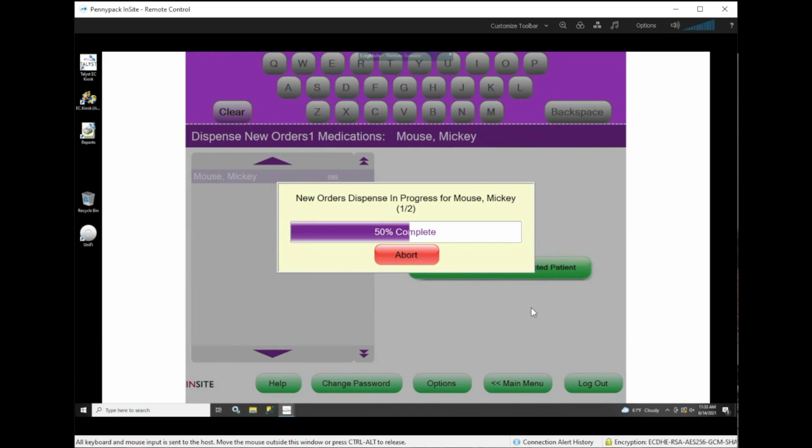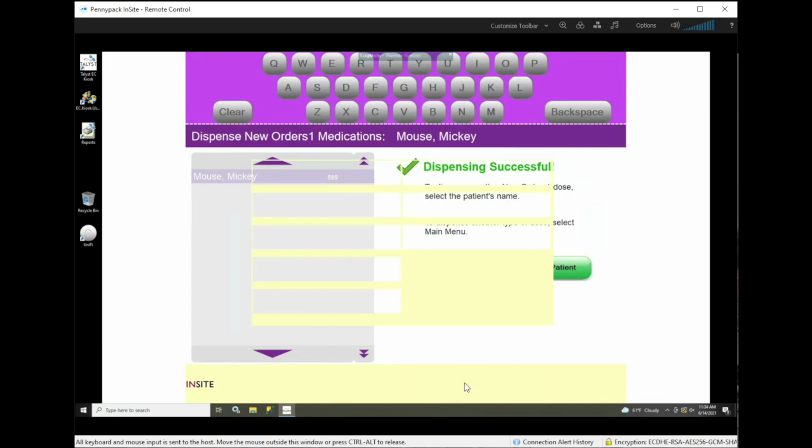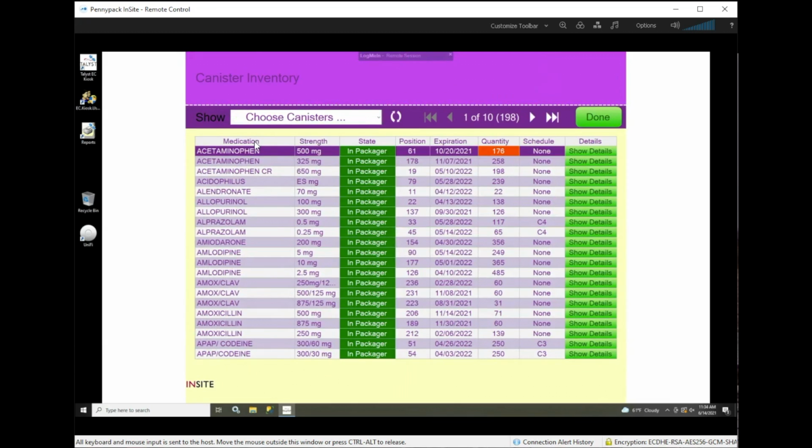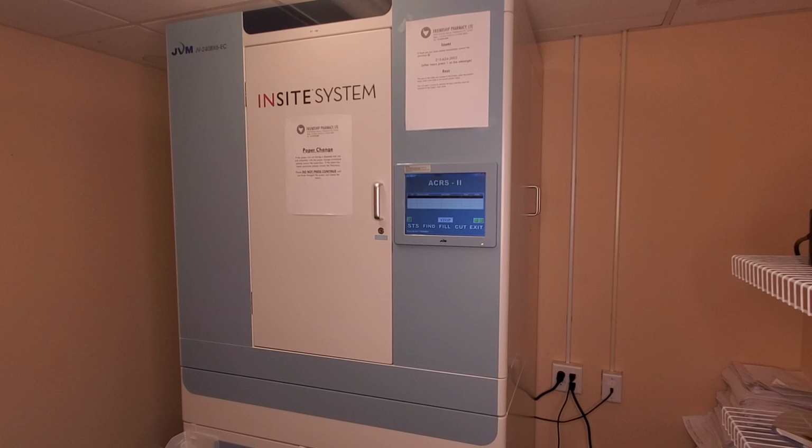So what we need to do in those cases is find the name of the canister and where the canister is in the machine. In order to do that, first we need to get the error message that tells us the medications were skipped, find out the name of the medication, and then go to Options, Show Canisters, and look for the canister that has an orange box in its quantity. Then we need to look for the position number, which will tell us where in the machine it is located. So then we can come and get the key from the Omnicell or the Cubex, and we can begin to look for the canister.